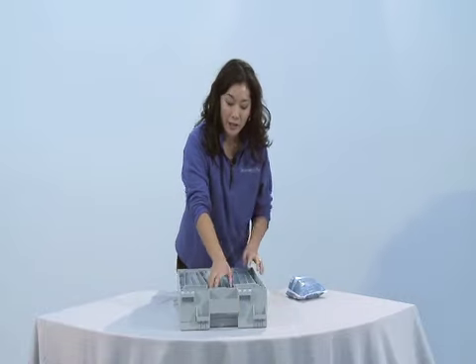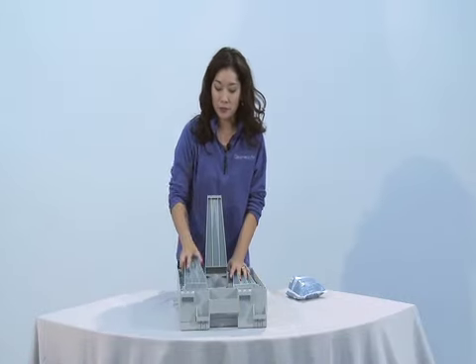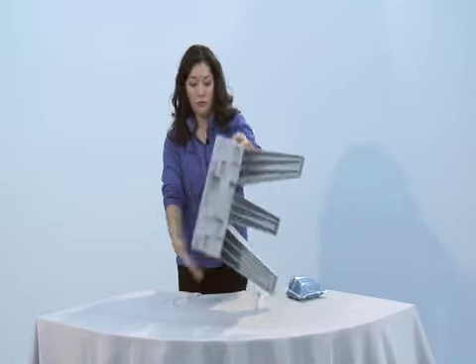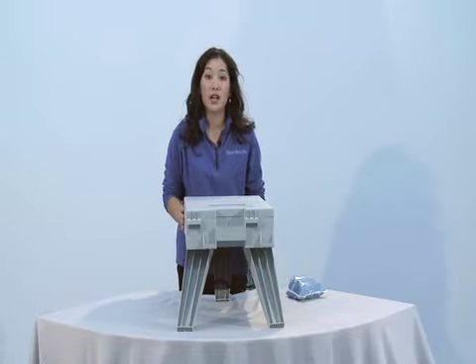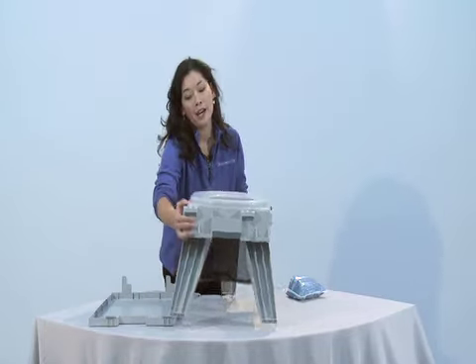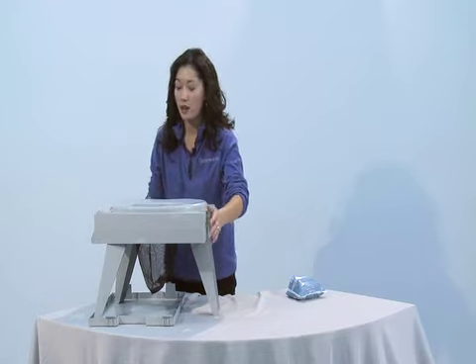Simply fold open the legs until you hear a clicking noise. Remove the top cover and place it behind the back two legs for stability on soft ground.